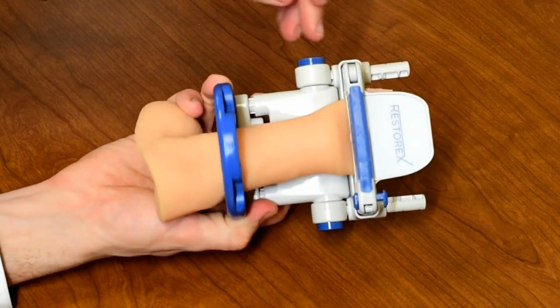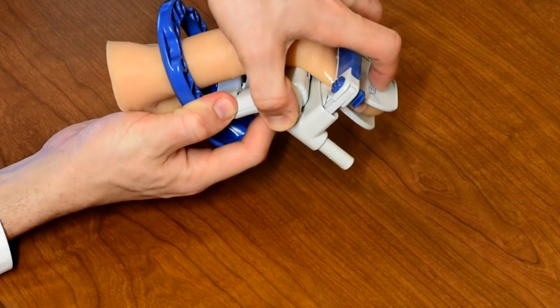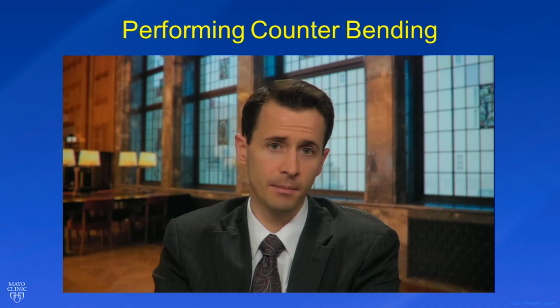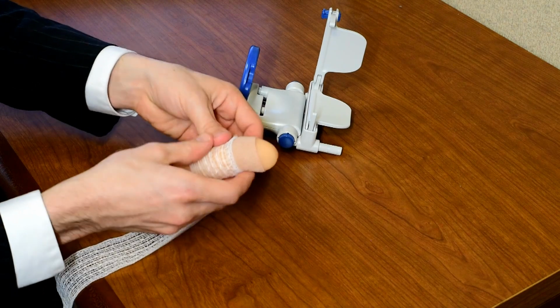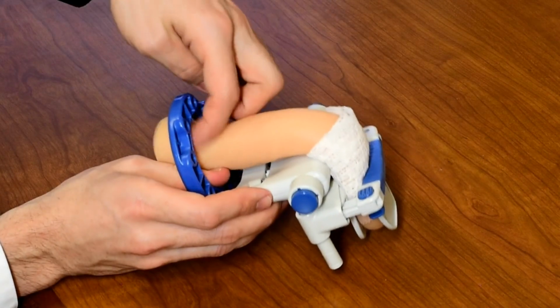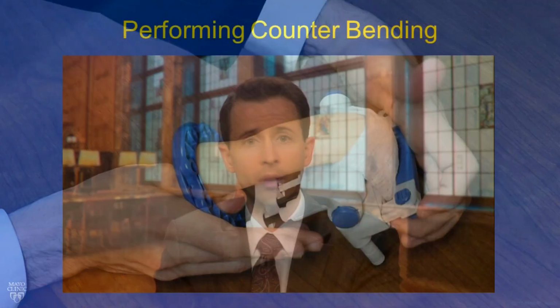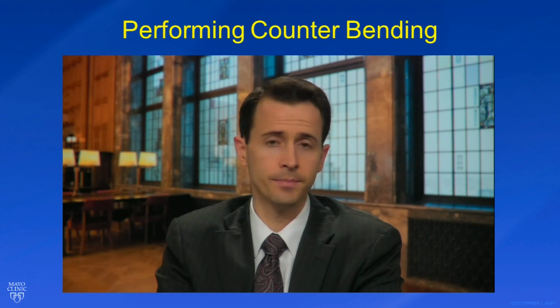Once you have the tension released, you can then counterbend the penis, and as mentioned before, the best results are achieved when you're able to get to the 3rd or 4th position. As with straight traction, often the penile skin will get caught either at the base or at the area of bending. This can be prevented by wrapping the area over the bend with gauze, toilet paper, or something similar. This allows the penis to slide more easily, and as mentioned previously, you can still run your fingers around the inside of the base ring to free up any penile or scrotal skin so that the skin itself is not being overly stretched. Again, this is one of the most common causes of pain with counterbending and can be easily improved with just these steps.